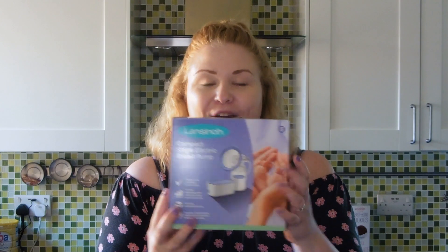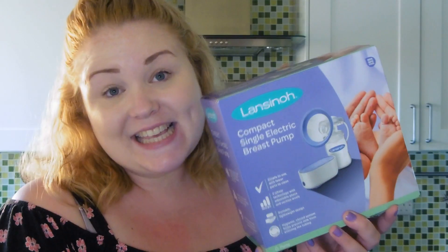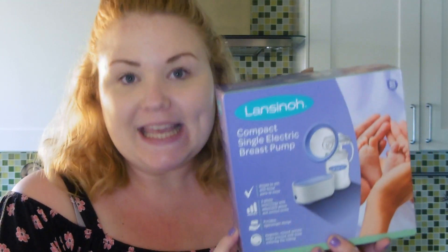Today I wanted to share with you something that is super, super exciting. Lance and O have sent me their brand new compact pump and I wanted to give you a quick rundown and a quick review. So this is the Lance and O compact single electric breast pump — it is compact, it is a breast pump, it is a single pump, and it is electric.